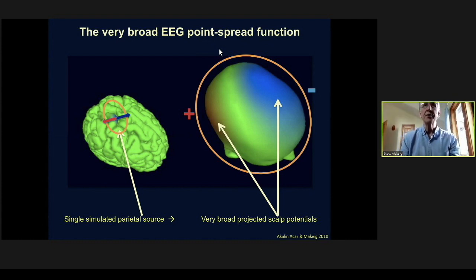To all the scalp surface, except for an equator line here where the potential is not registered. Now, in an actual EEG recording, there's always two ends of the channel. So for instance, if you had this channel somehow, that would be called F4 to P4, maybe something like that. It would record no signal. Why? Because both of those electrodes receive the same signal from this source. So that channel would be invisible to this source.